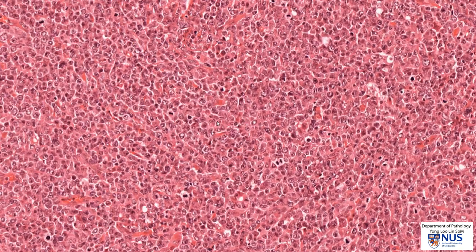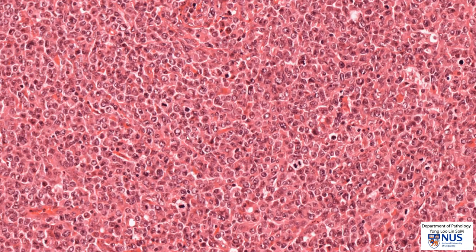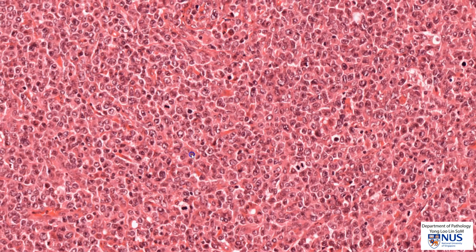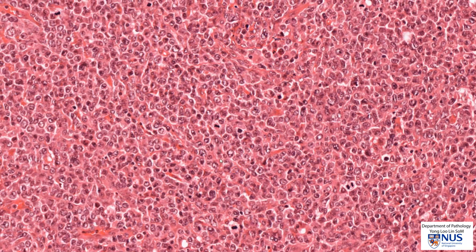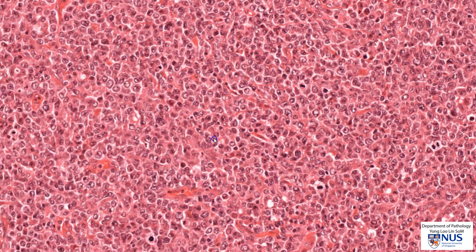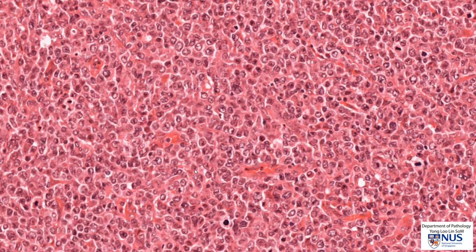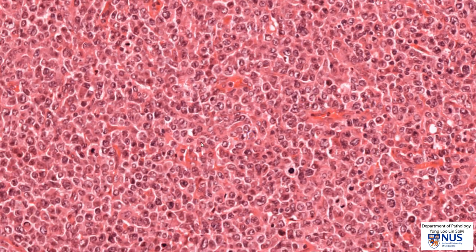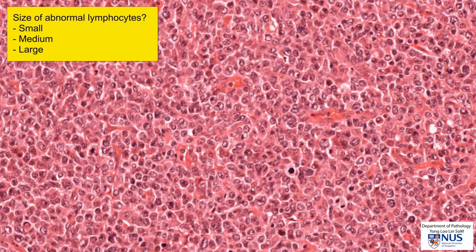Let's take a higher magnification look. We can see that the proliferation is composed of lymphocytes. Many of the nuclei are very pale — quite translucent with open chromatin — and some of them have slightly irregular nuclear outlines. For example, this cell is a little bit irregular, and some of the cells also have fairly prominent nucleoli. Looking at this cell here, we can see a prominent nucleolus. We're now going to figure out the size of these abnormal lymphoid cells.